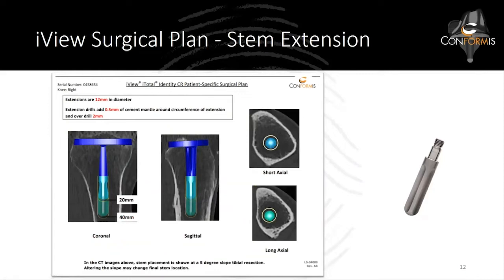The third view, which is new to the identity, shows the stem extensions. These are always 12 millimeters in diameter and come in 20 and 40 millimeter lengths, according to surgeon preference. In the sagittal view, there's a five-degree posterior angle to the stem as it attaches to the base plate, with five degrees of slope built in and the keel offset posteriorly. If you're doing an anatomic slope approach — say the tibia is 10 degrees — you want to pay attention when using stems, as you might run into the anterior cortex. This view will only show you the five-degree cut.